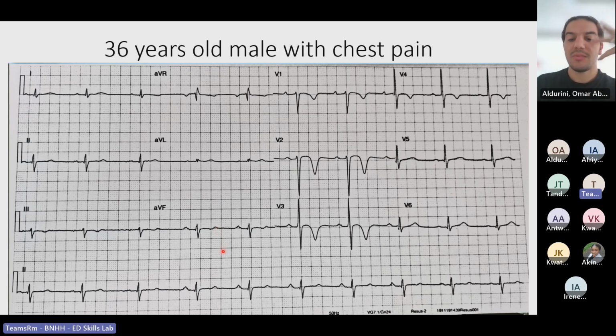Okay, so the first step is the first complaint. The second step is standardization, and we said it's standard. And the third step, I'm looking at the waves, P, QRS, T, and they are all present. Then I am still looking at the waves, whether there is any change in their normal behavior or not.